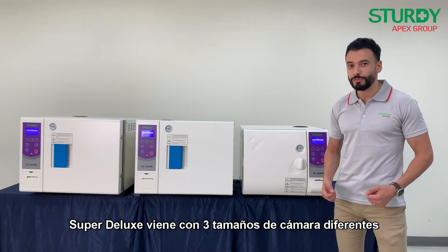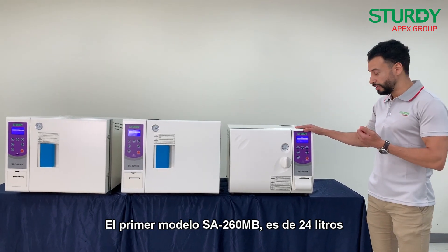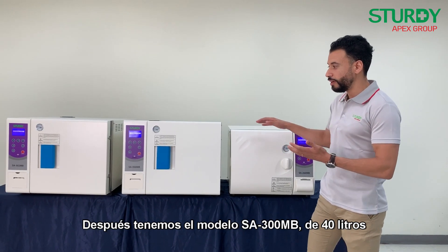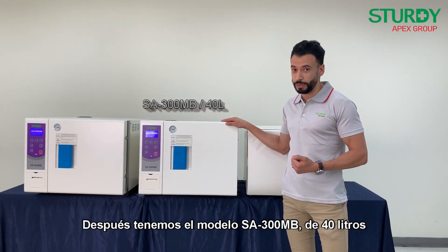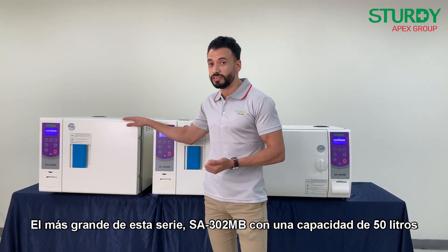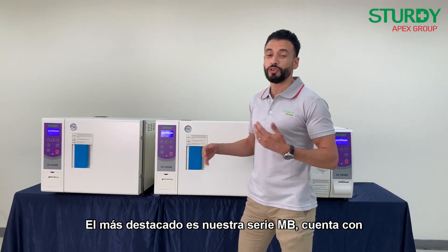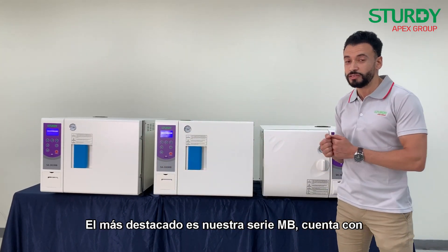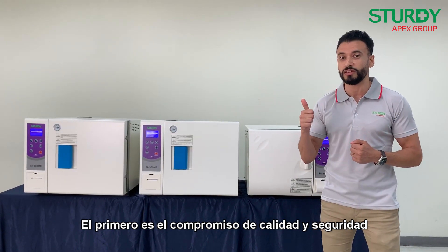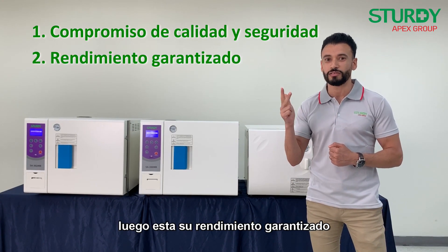The super deluxe comes with three different chamber sizes. The first one is the SA 260 MB at 24 liters, then we have the SA 300 MB at 40 liters, and the largest is the SA 302 MB at 50 liters. Most importantly, the MB series comes with three key aspects: uncompromising safety, guaranteed performance, and convenience.